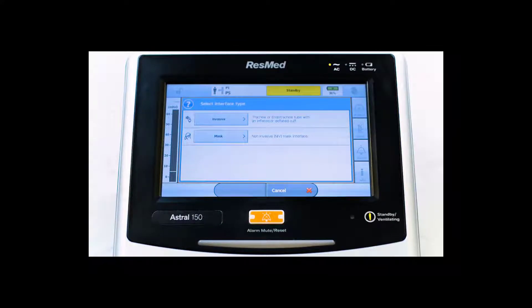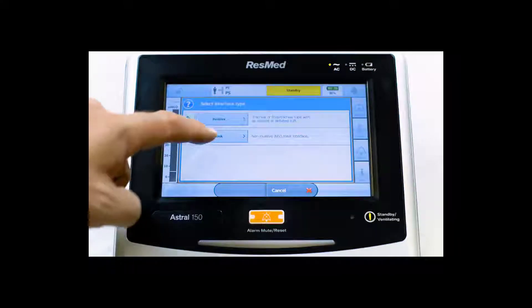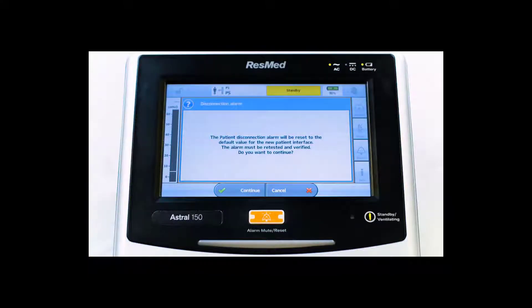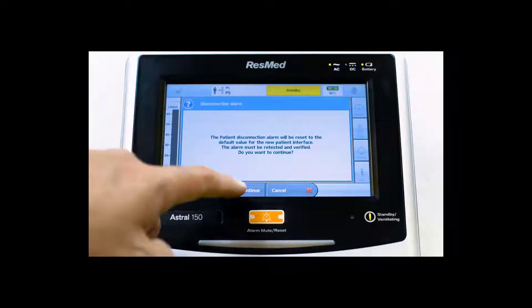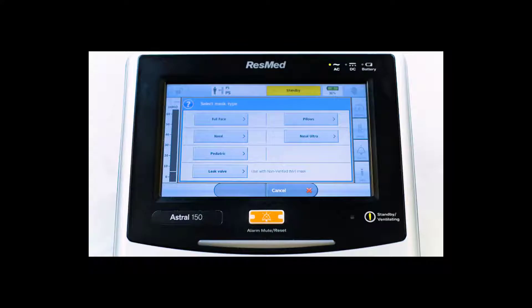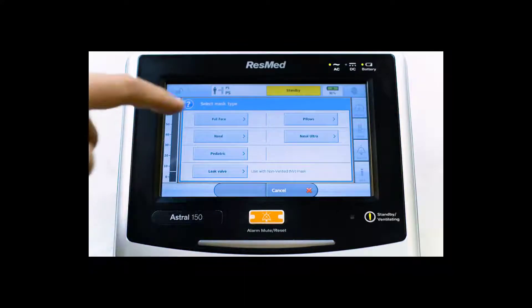Now it is time to select the interface type. Our patient is on a full face mask, so we first select Mask, which prompts a message explaining that the patient disconnection alarm will be reset to the default value. Select Continue. Now we select Full Face Mask.